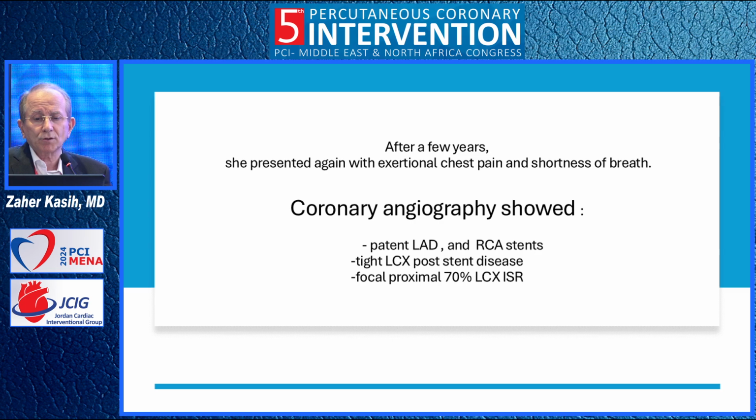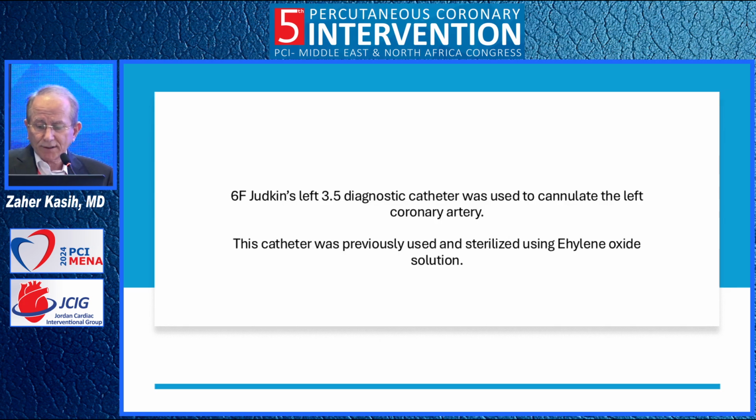Coronary angiography showed patent LAD stent and RCA stents, showed tight left circumflex post-stent disease, and focal proximal 70% left circumflex in-stent restenosis. A 6 French Judkins left 3.5 diagnostic catheter was used to cannulate the left coronary artery. This catheter was previously used and sterilized using ethylene oxide solution.